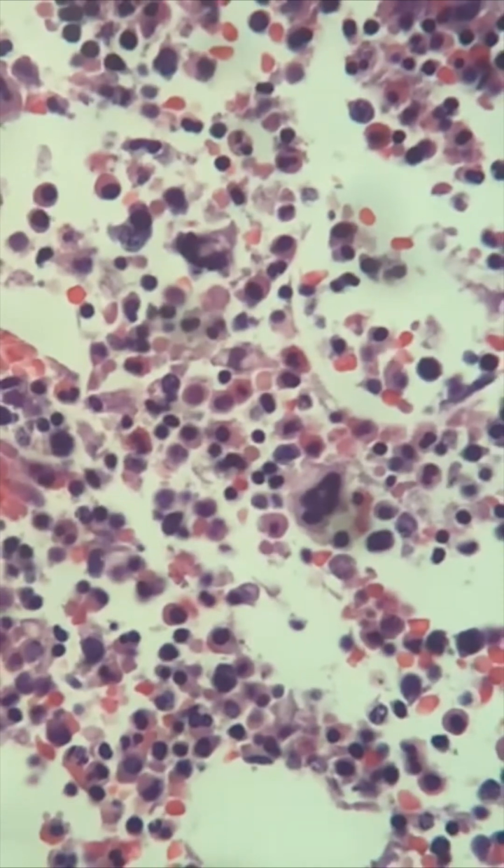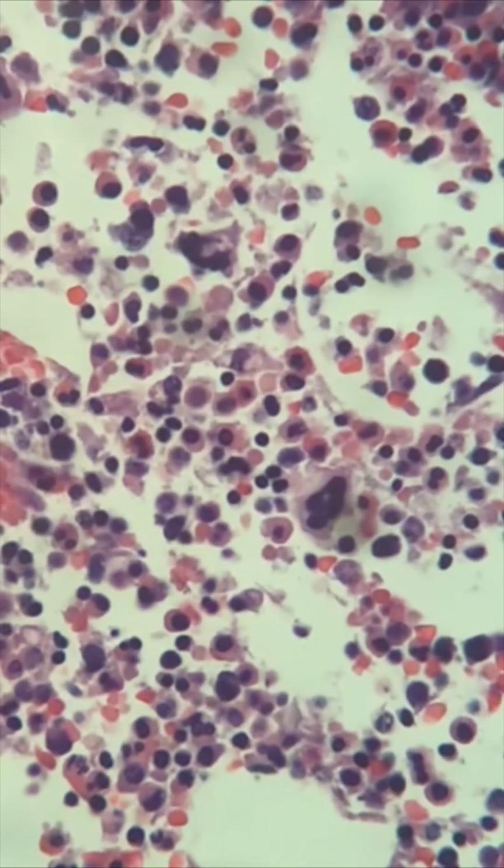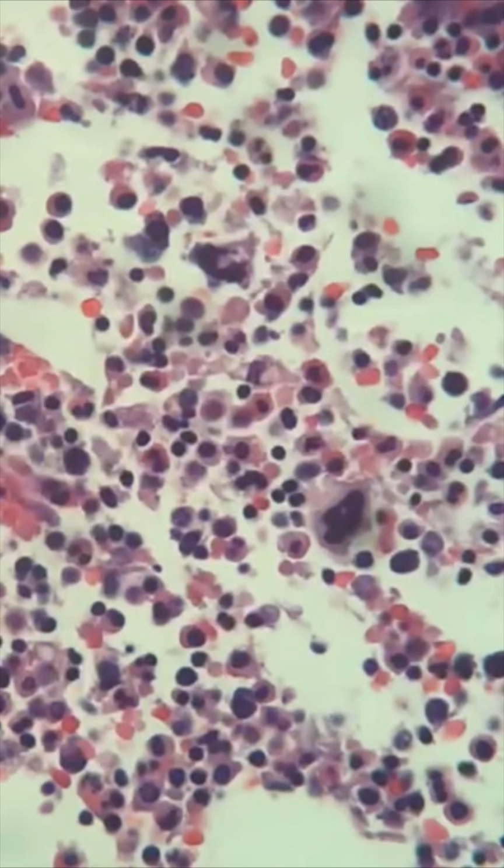When you see increased megakaryocytes, you normally don't see megakaryocytes this close together. So when you see that, erythroid and megakaryocytic hyperplasia usually go together. All right, that's lesson 101 in histopathology. You listen to these other folks who want to tell you by opinion. I show you the evidence, and that's why I keep my practice completely transparent.